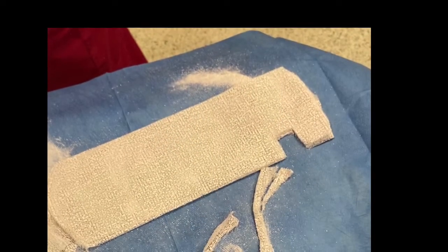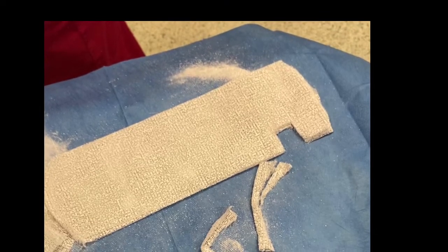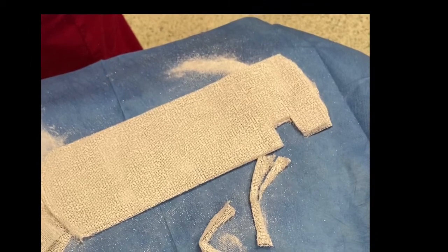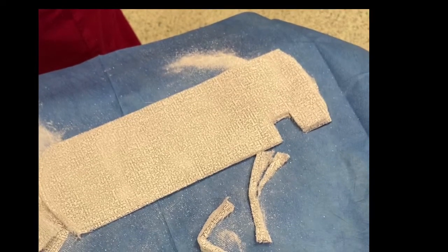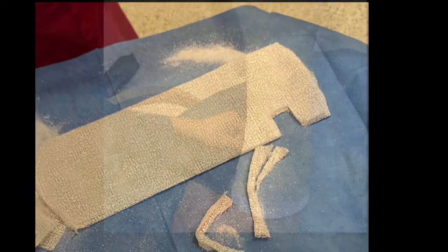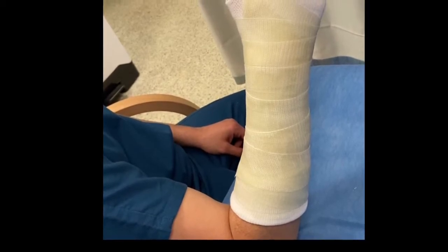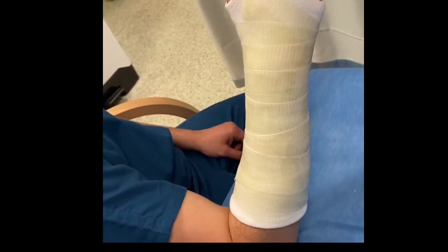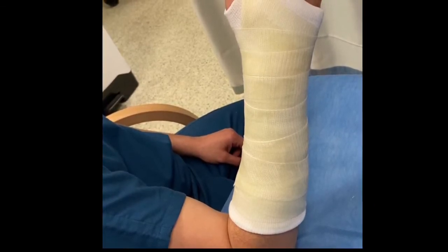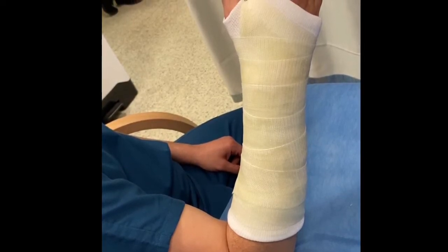Casts can be made from a number of materials. Typically, plaster of Paris has been used and often still is in accidents and emergency departments as it is cheap and easy to handle. The disadvantages are that it is heavier and takes a longer time to set properly, usually several hours. Fibreglass is lighter and sets within minutes, however it is difficult to handle and expensive. A back slab will usually be replaced with a full cast once the swelling has gone down, and therefore there is often little advantage in using fibreglass in the acute situation.